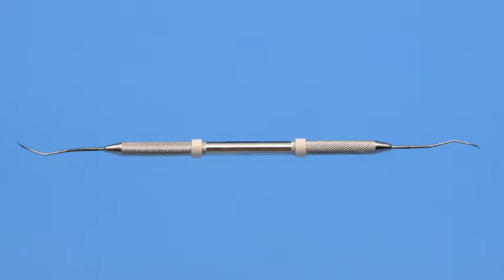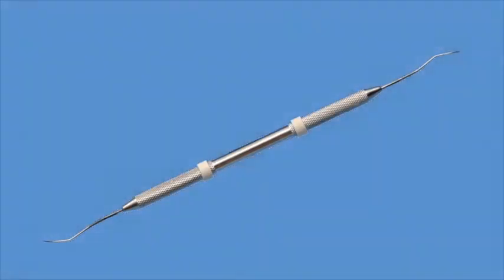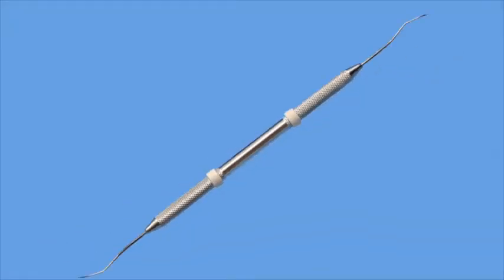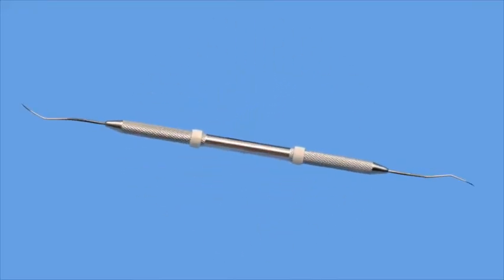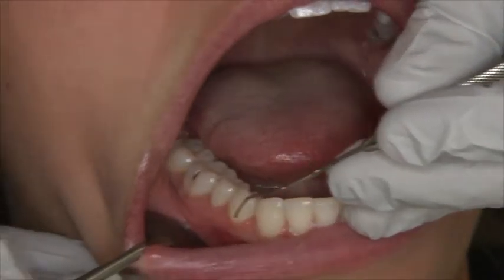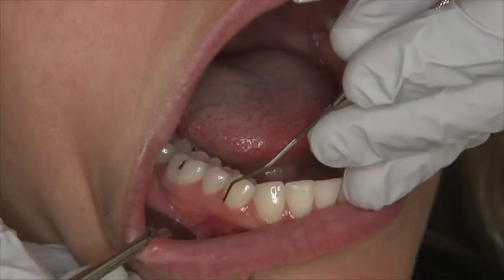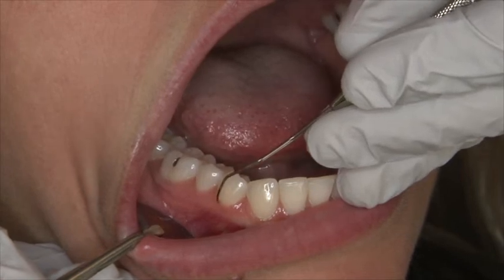This film is an instructional video on the use of the ODU-1112 Explorer. At the completion of this lesson, the student will justify use of the ODU-1112 Explorer, identify the correct working end of the instrument, and use the ODU-1112 Explorer efficiently to detect calculus and explore tooth anatomy and periodontium.